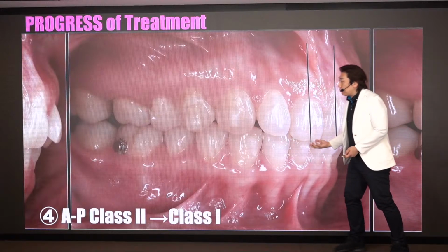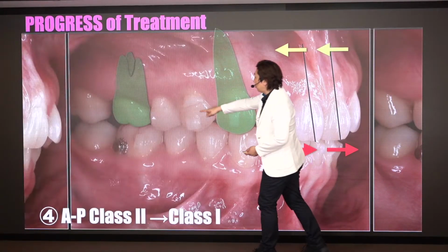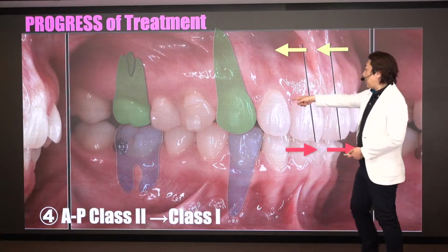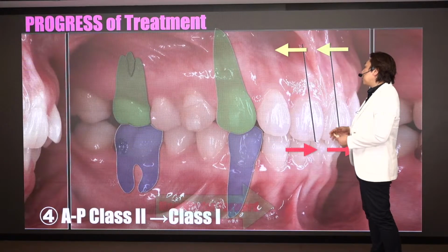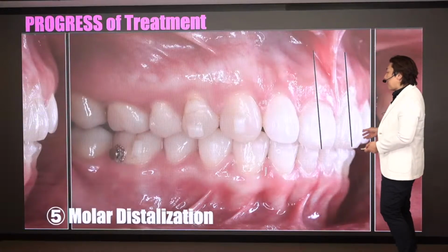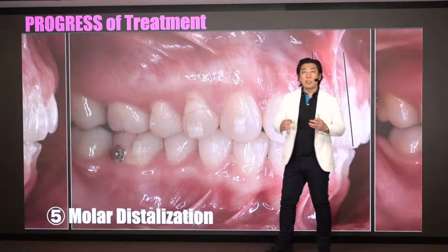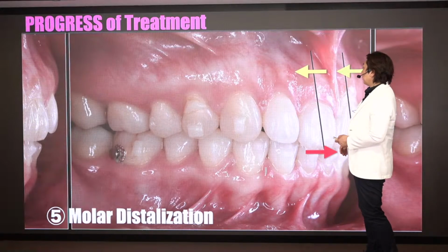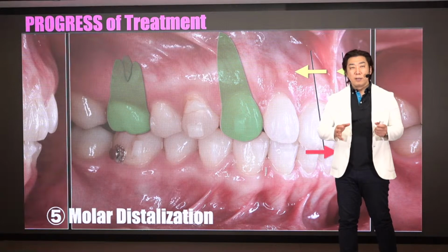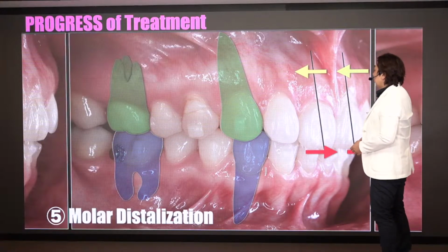Then the mandible shifts forward. Then the teeth position, the canine and the first molar, is different. As you can see here, this is edge to edge. The first molar is almost a little bit of a class 1 relationship. Then we start the refinement, the molar distalization phase. You can see here that a class 1 relationship is achieved. No need for any TAD, no need for any multi-brackets braces, only the simulation idea, positioning the patient for the joint.